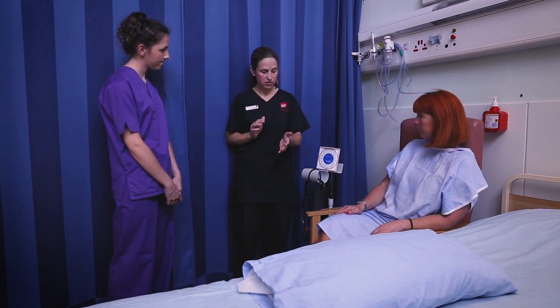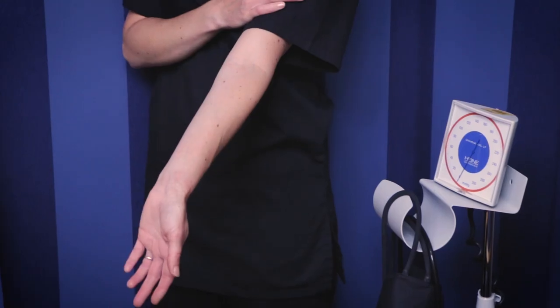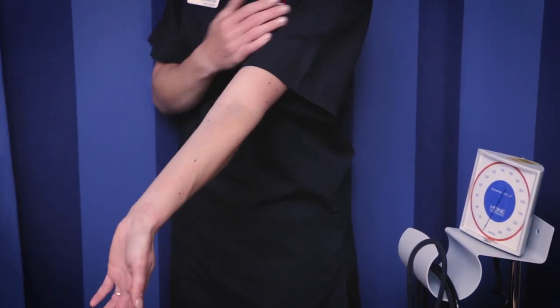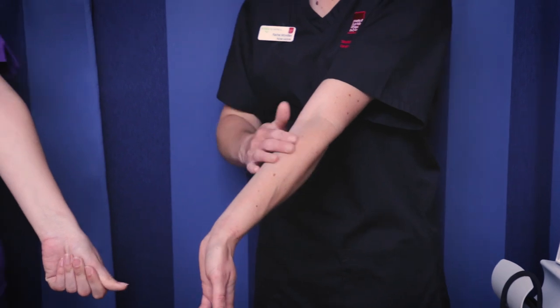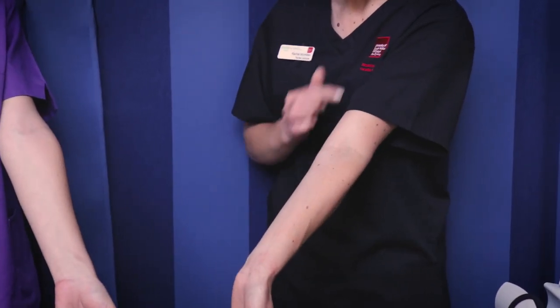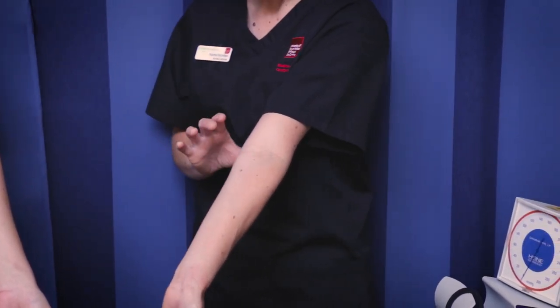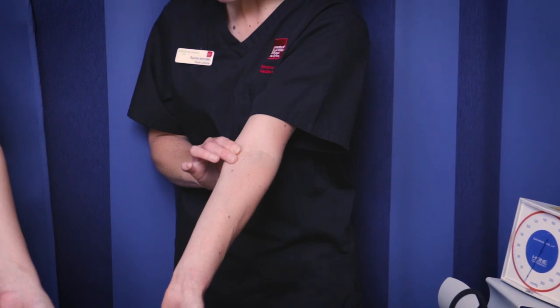In order for the technique, first of all we need to be able to locate the brachial artery, because we're going to take the blood pressure on the arm. This area of the arm is called the antecubital fossa — at the inside of the elbow — and there's a main artery called the brachial artery that runs down the arm. So if you try and palpate your own brachial artery.